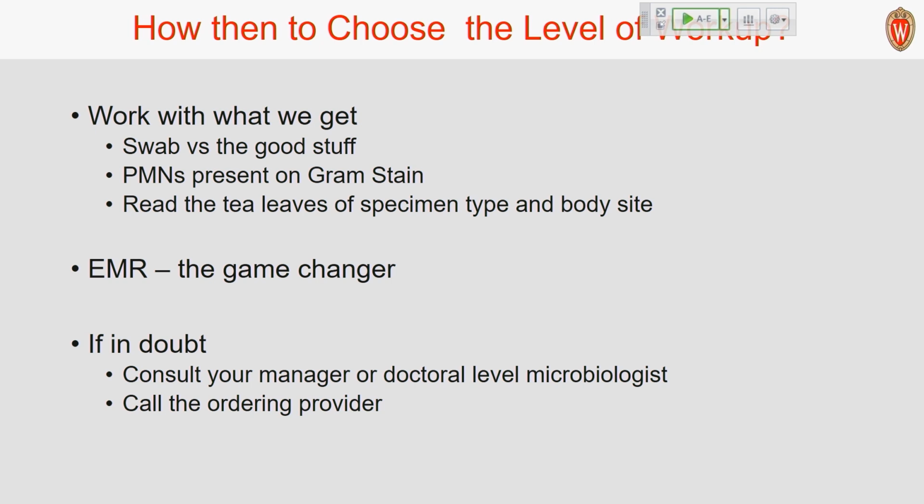We have encouraged our techs to use the clinical side of the EMR, and they don't do it in any deep way. But we just say, if you don't know whether it's superficial or deep, just find the doctor who ordered it and the date the culture was collected, and look at their note. Did the patient come in because they have this flaming lesion on their abdomen? Or did they come in because of uncontrolled diabetes and they said, oh, doc, I got this little thing here, let's culture it? It's very easy for techs to figure that out by just using the EMR.